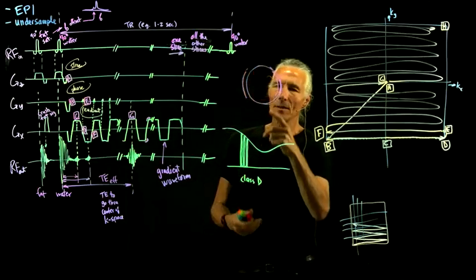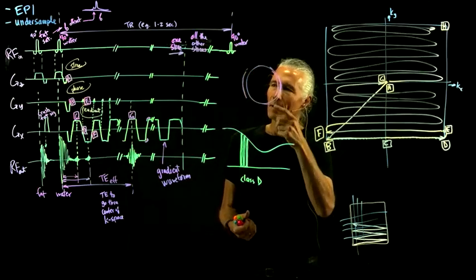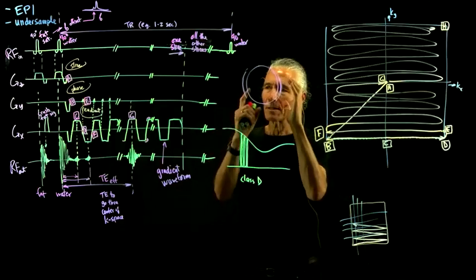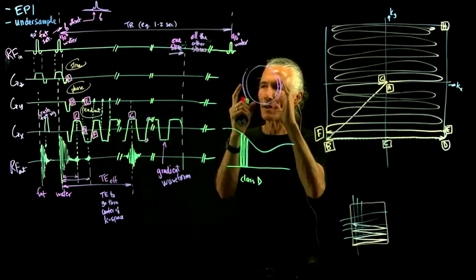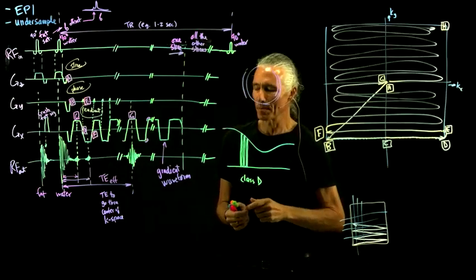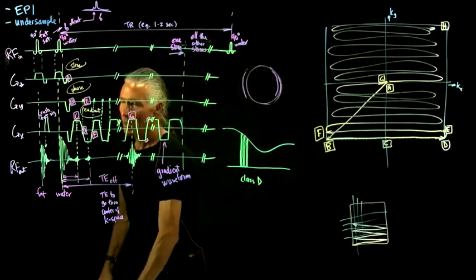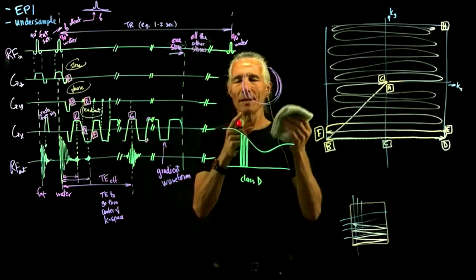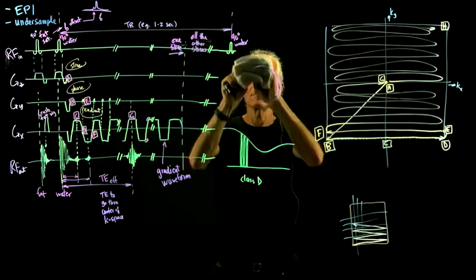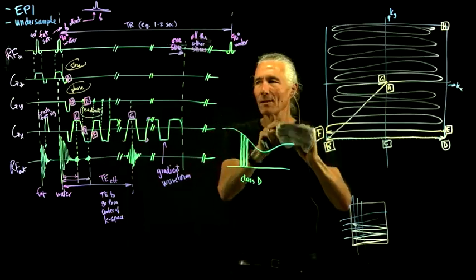And you can just tick it off on the EPI and just suddenly you'll see the fat get brighter, and then you'll get this little sort of ghost. But it's often used in other sequences, so it's not just this one, but it's almost virtually always on here, just because we're almost always recording the brain.